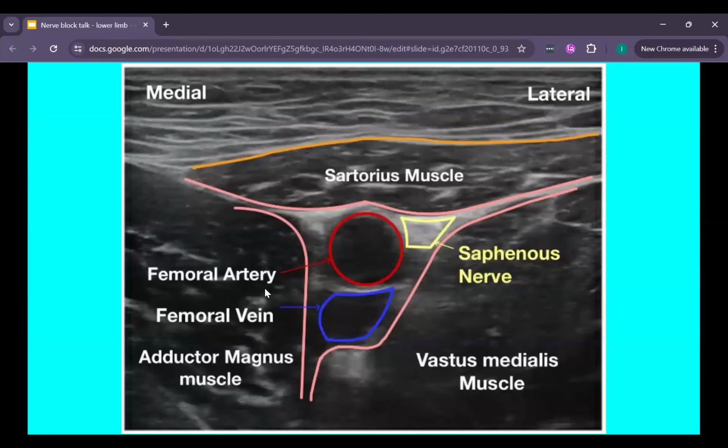We normally aim for that middle to distal third. The risk of doing the adductor canal block a little bit higher is that we can get local anesthetic spread proximally, and then we can start to get more of the femoral nerve blocked, and that can lead to quadriceps weakness, which can lead to falls if the patient's mobilizing after this block. If it's done in that distal third, it should just be a purely sensory block. So the patient should still be able to mobilize immediately after surgery if the surgeons are happy as well.